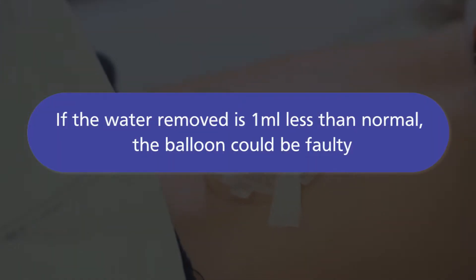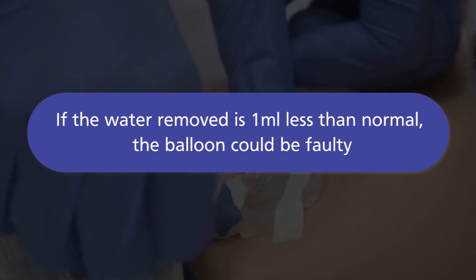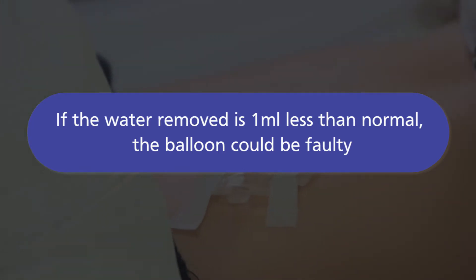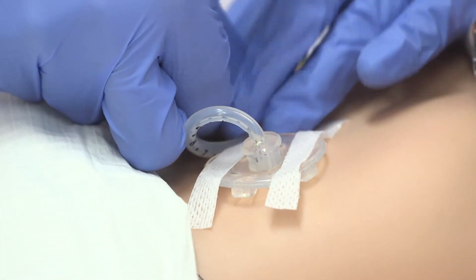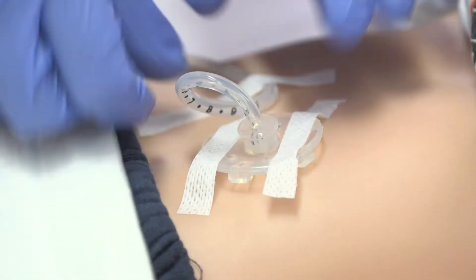If the water removed from your balloon is more than one mil less than normal, this could be a sign that the valve or balloon is faulty. You need to tape the tube down and speak to the health professional who supports you at home for advice.